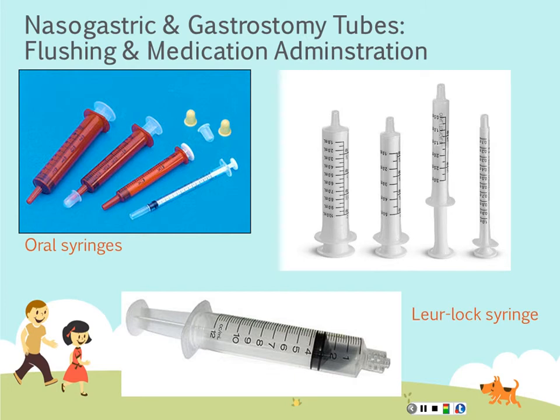Because of the cost and availability and things like that, some facilities may choose only to have Luer-Lok syringes, which are traditionally what are also used for your IV and intravenous medication delivery. The bad thing about using a Luer-Lok syringe is that if one is left out, someone could inject whatever you've put in it into someone's IV, causing injury, death, things like that.